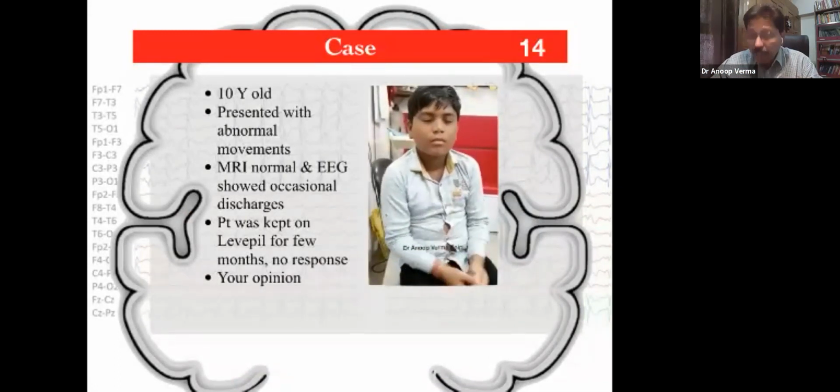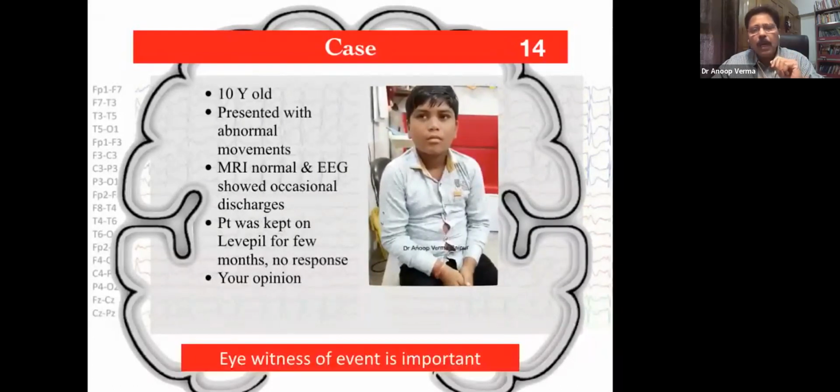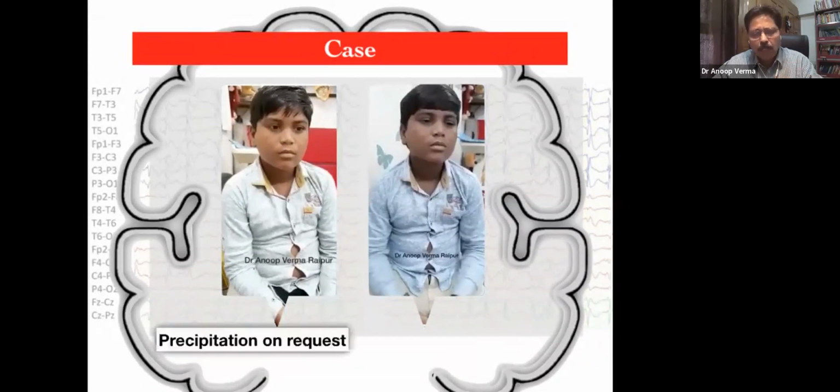So it is very, very important to see in person, either on video or in front of you, or through an eyewitness account. This is very, very important in any patient of whether it is non-epileptic. Now, see, I have advised him to start the paroxysm. He started that. This is again a very peculiar thing, a precipitation of the discharge on request. And you will see when I say yes, now stop the convulsion, he will stop.